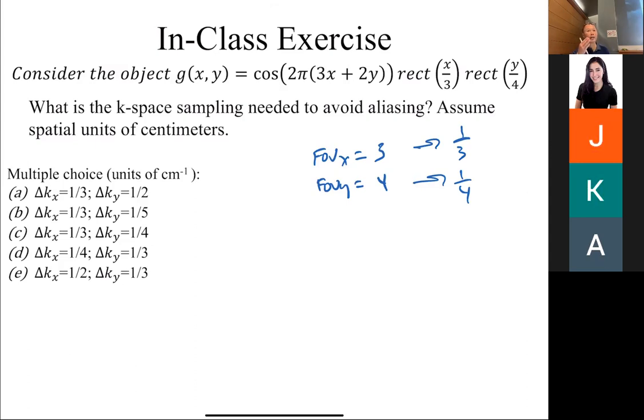So these are exactly the design decisions you make when you're out working in the real world. There are thousands and thousands of MRI methods that have been developed. Maybe 10 to 50 are actually used in practice. What happened to all the other thousands that were developed? Either they're too slow, too expensive, they didn't work all the time, so these are all the things that prevent things from being adopted. Okay, or else it didn't have a good name. Marketing also matters. Okay.